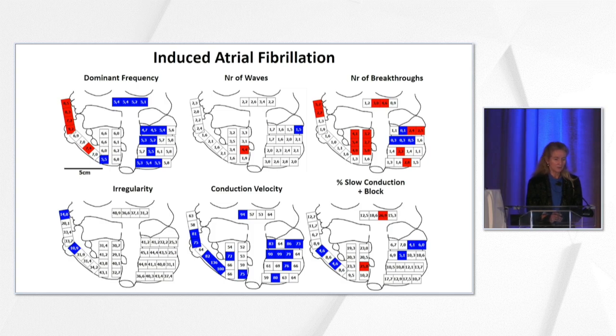This is just a few examples. So what we want to do is to compare all variables between the different types of atrial fibrillation. And just to show it very quickly to you, we gave them the colors of the Dutch flag. So if you are on average, it's white. If you are higher and you go in a parameter to electropathology, it's red. And if you are below the average value, but it means no electropathology, it becomes blue.